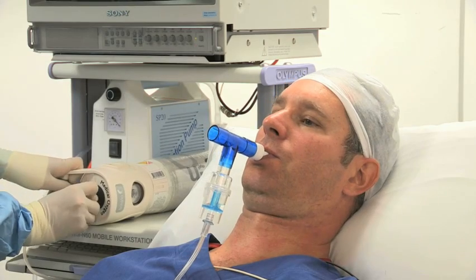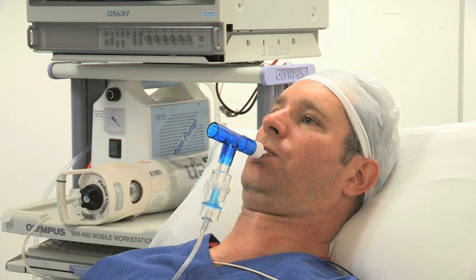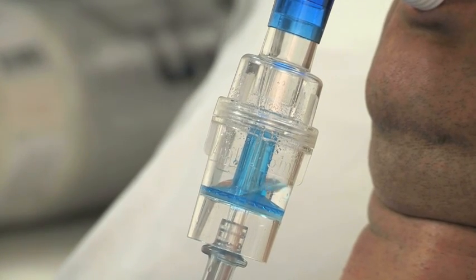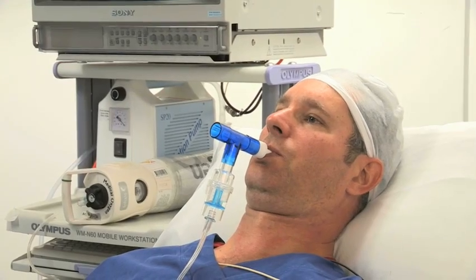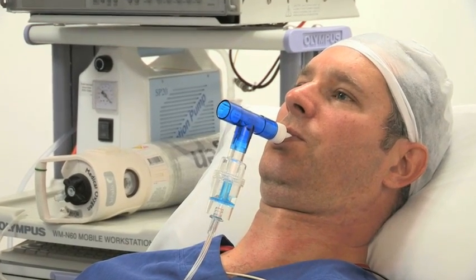With the oral topicalisation regime, the emphasis is on obtunding the gag reflex more so than with the nasal route. The oral nebulizer is set up to avoid wastage of lignocaine. Here we use a mouthpiece and ask the patient to only breathe through the mouth.